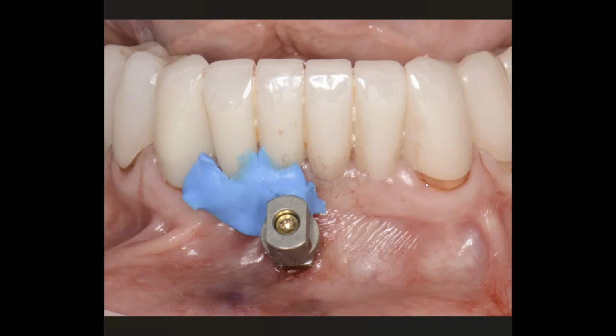And if I put it down in the mental symphysis, it's out of the way of my alveoloplasty completely. So I put that thing down in the chin, and he said, "No, you're doing it wrong." And then he washed and he said, "That's amazing." Now, flash forward, I understand a lot of people have been out there to their courses and they claim credit for this, but I actually have a video of him saying, "Oh my God, it's in the wrong place." I'm not going to show it here. But anyway, this is something that I developed here at the Atlantic Implant Institute.